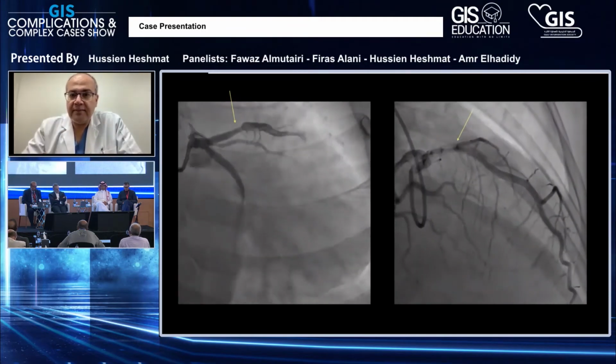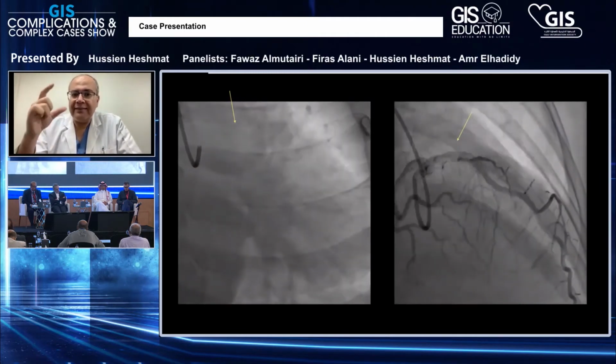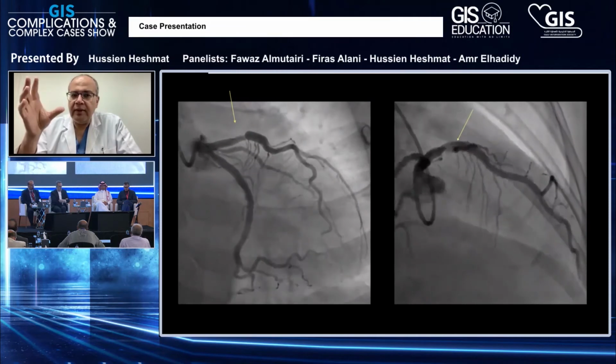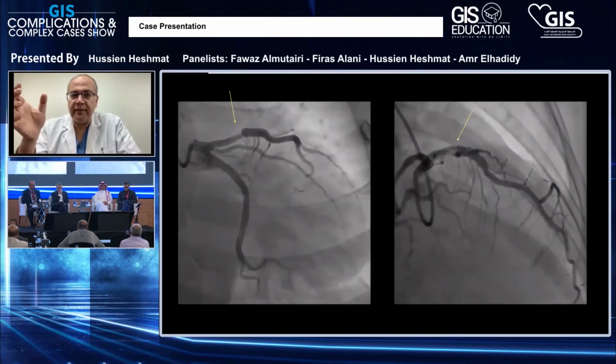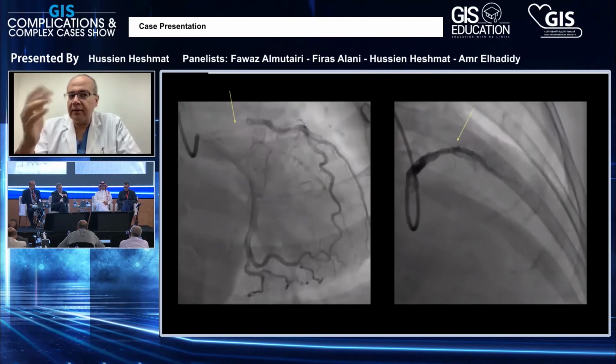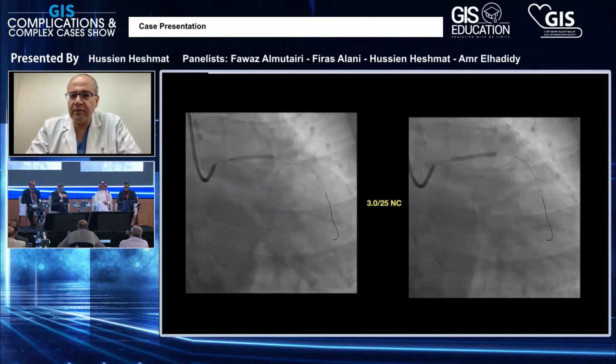This was back in September 2019, before the pandemic. And at that time, we were familiar with using the self-apposing stent, the Exposition stent. Based on our assumed diameters, we pre-dilated, of course, heavily with a 3.0 by 25 NC balloon, because these stents need proper lesion preparation.